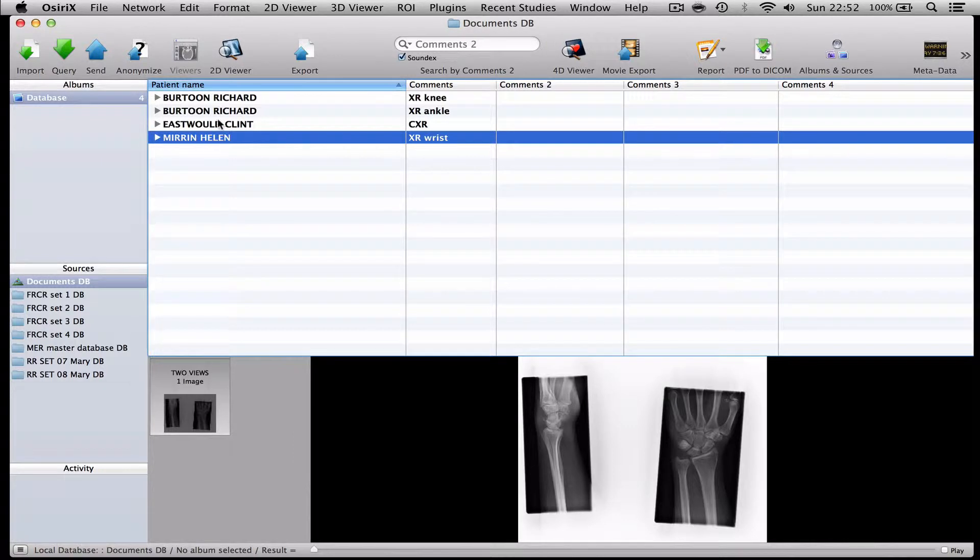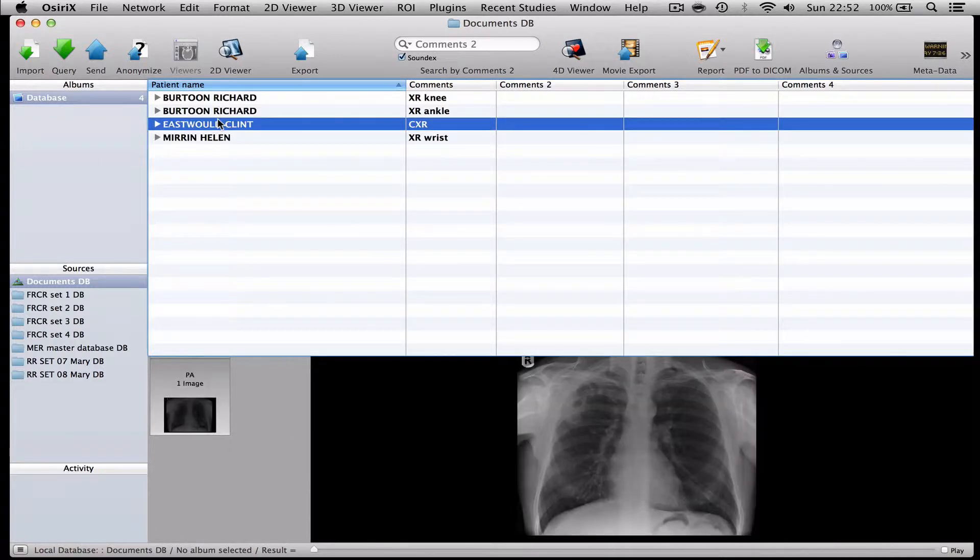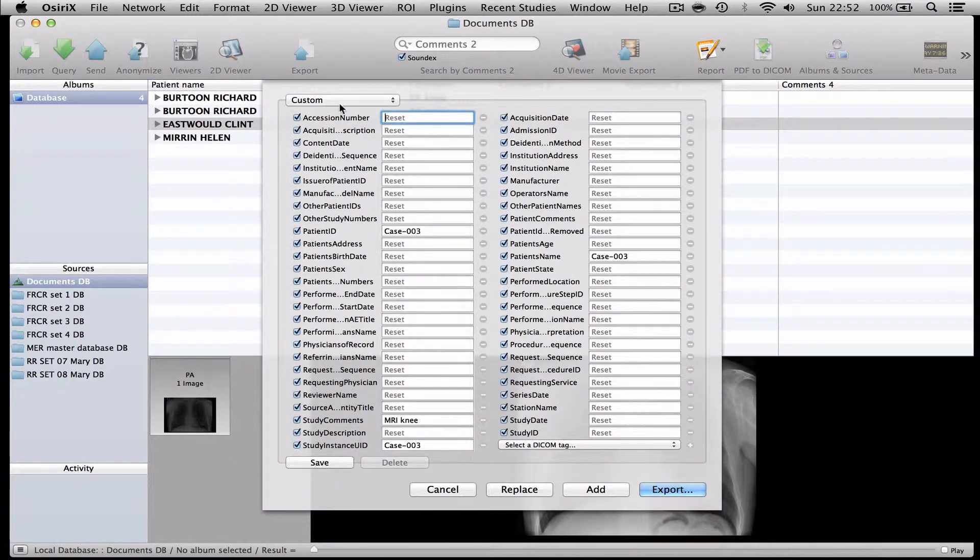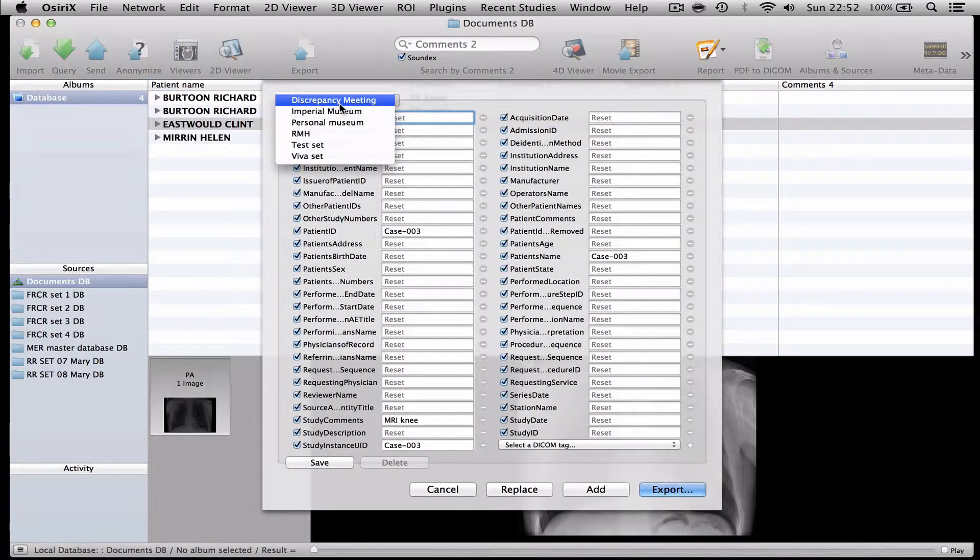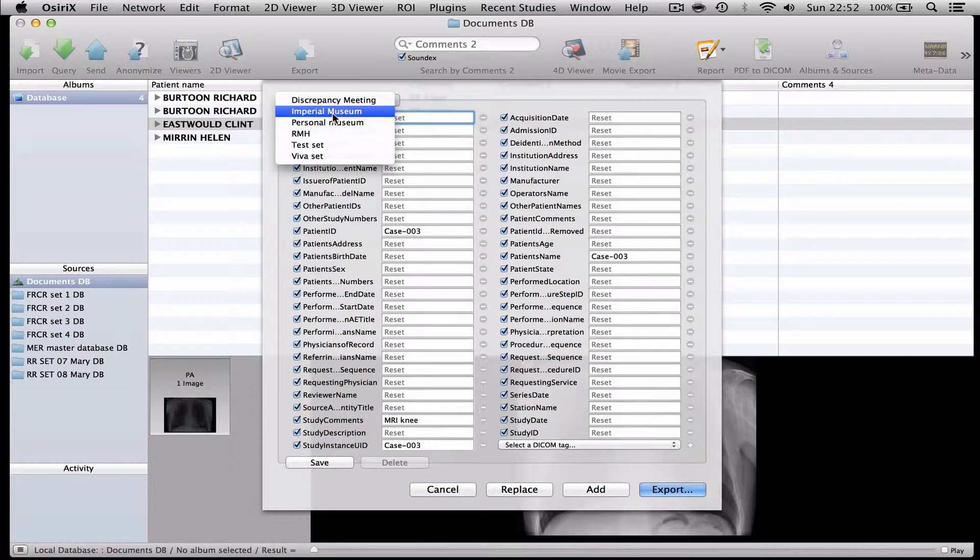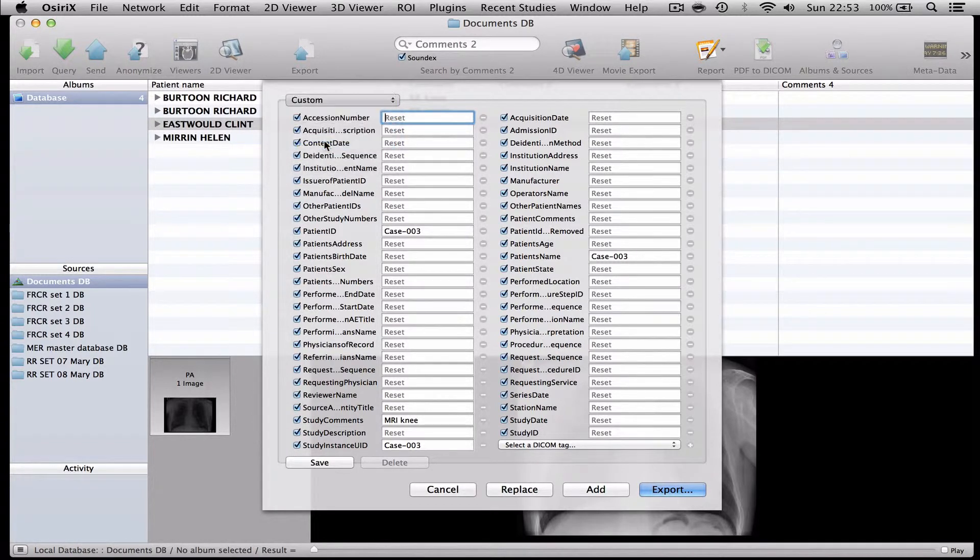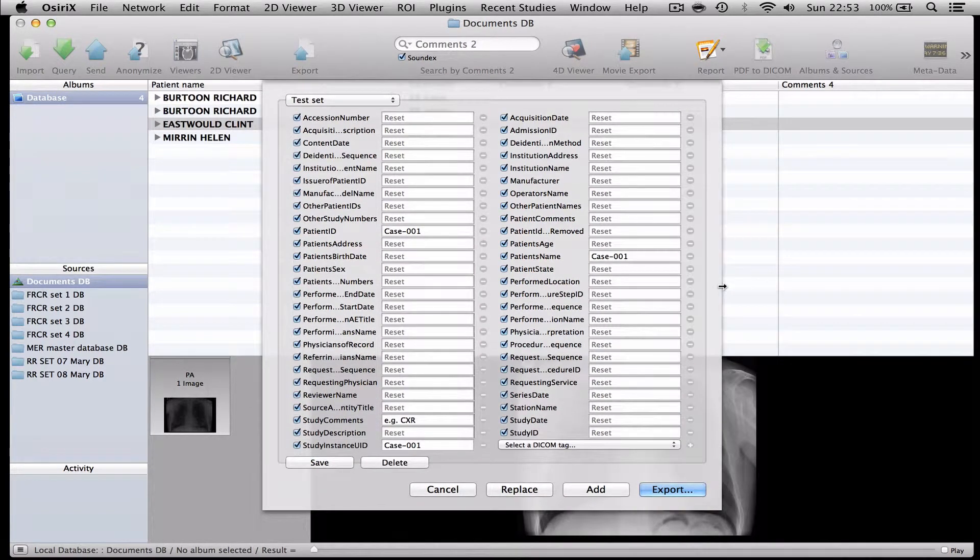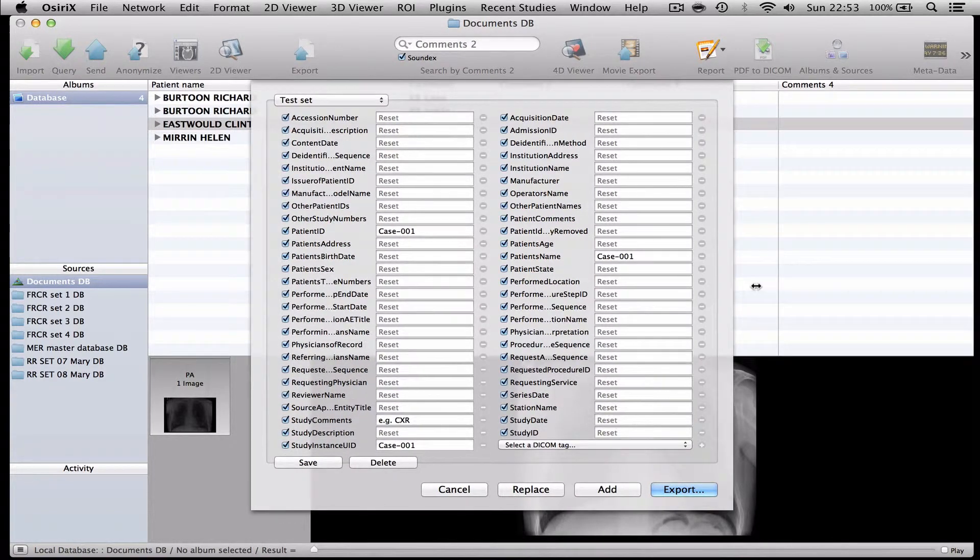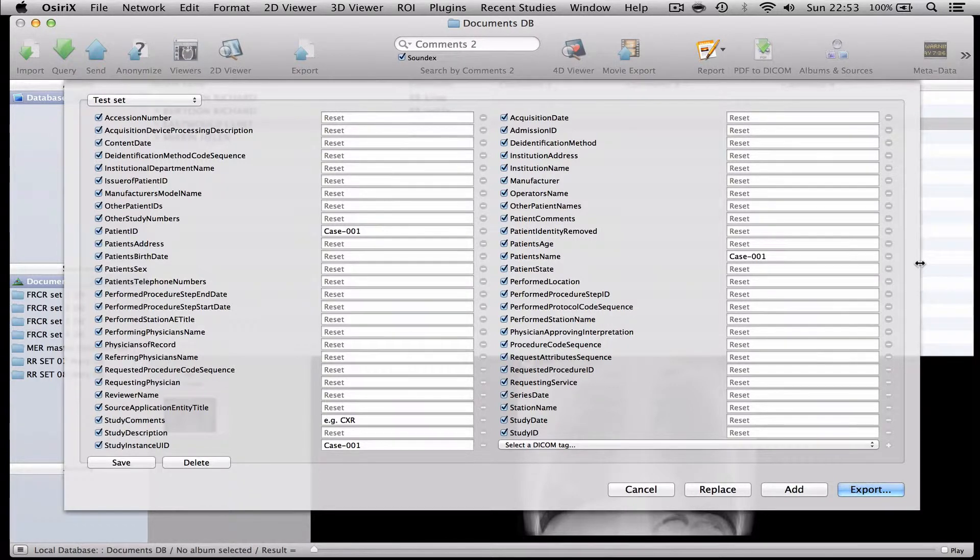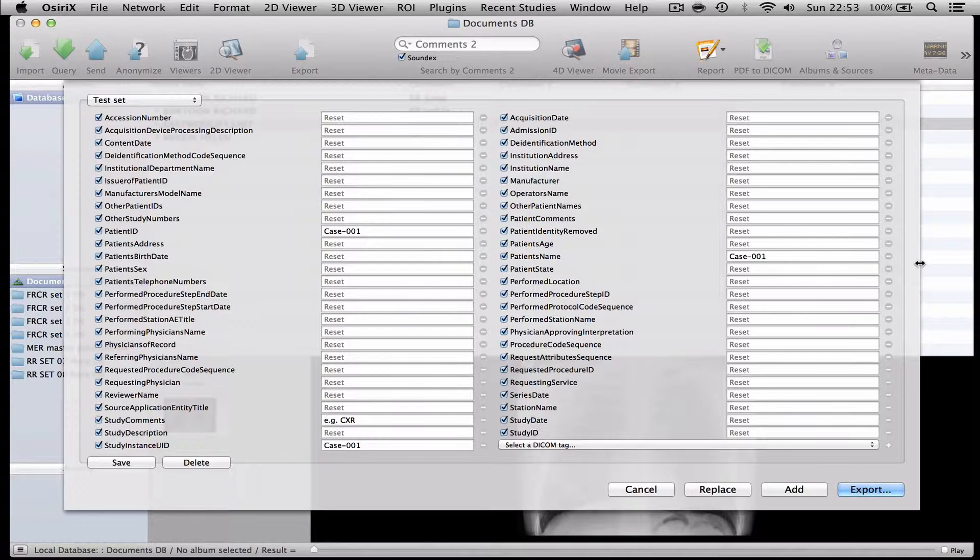Now let's go to Clint Eastwood and his chest x-ray. What I tend to use is our anonymisation protocols within OsiriX and if I click on the anonymisation protocol and go to the list of different protocols you can see we have different protocols for anonymising for the museum, for our own teaching museum or the discrepancy meeting but the one that I'm going to use for this purpose is something called Test Set. That's a very simple anonymisation protocol and I'm going to just open out the box so that you can freeze frame and take these DICOM headers down if you want.